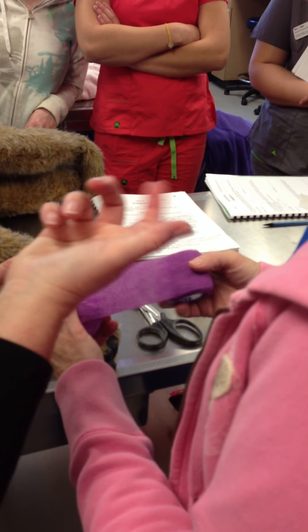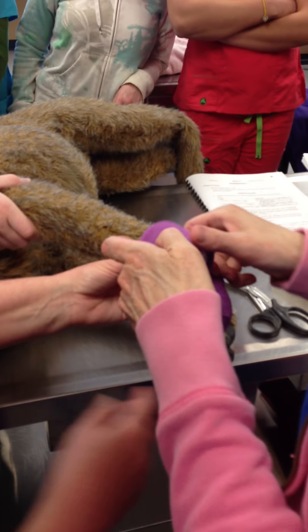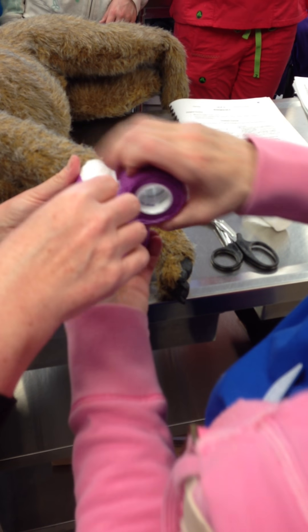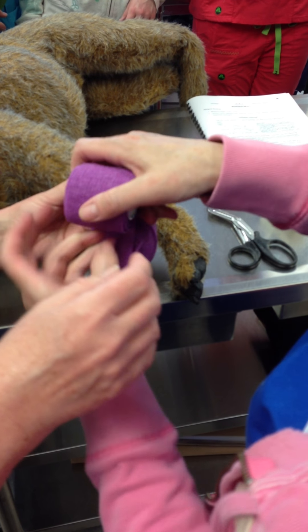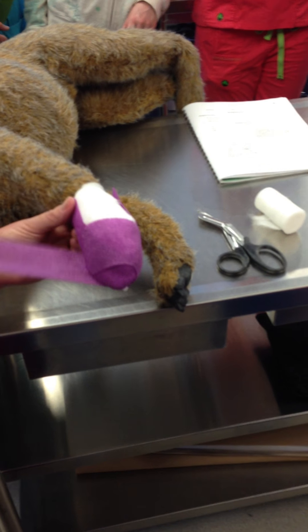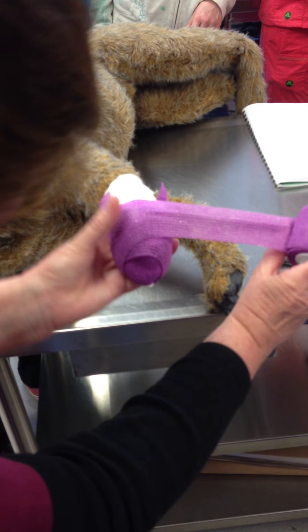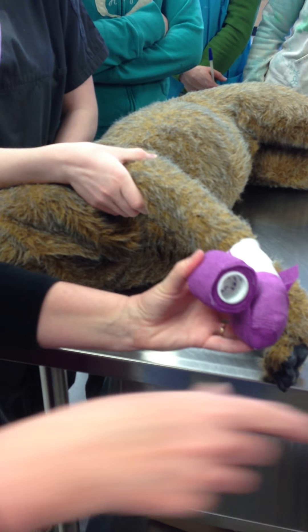Don't forget to unroll off the bandage — flip that over and unroll off your bandage. Now you need to come back down and just get that one; you can go up and then go around again. So I'll give you a hint so that that doesn't happen — do the move like you did, go up here and come back down. Like that little half figure eight.